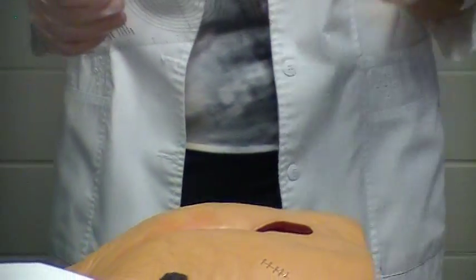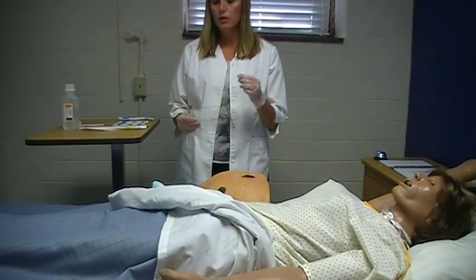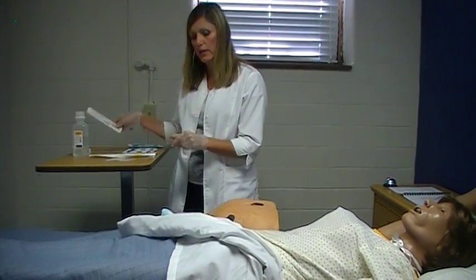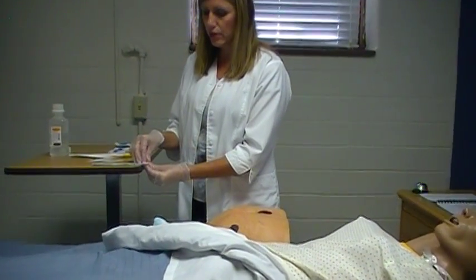You would want to document these measurements. If you have trouble remembering those numbers, I would have an ink pen handy to write all this down because you're not sterile at this point in time. So you can write on something, okay? Now you still have to measure the depth, and you've got to assess for any undermining and tunneling that may be present. That's going to require the use of a Q-tip.